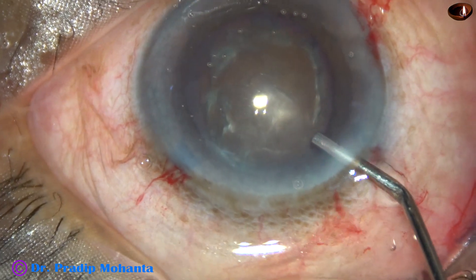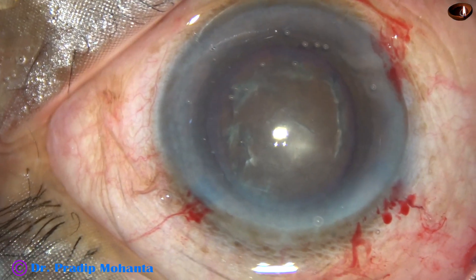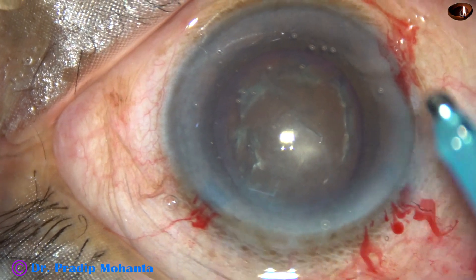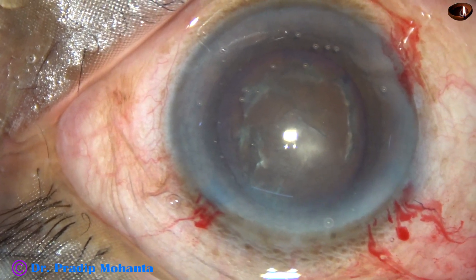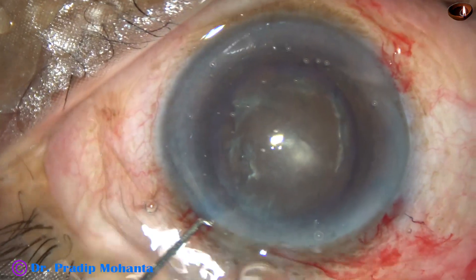Now let us observe submarine chop. The machine being used is Oertli Catarix 3. This technique can be tried with any machine.